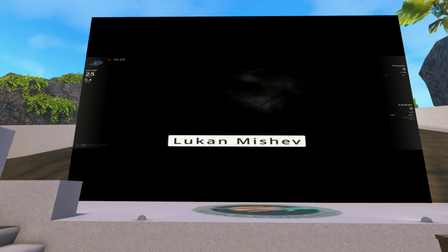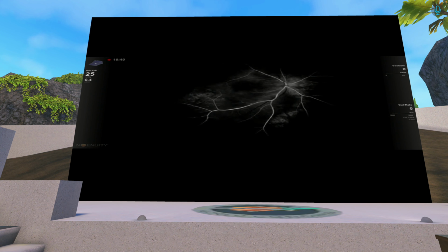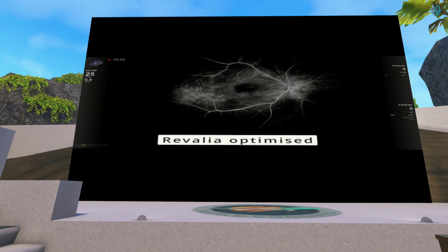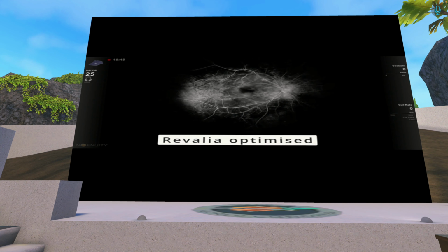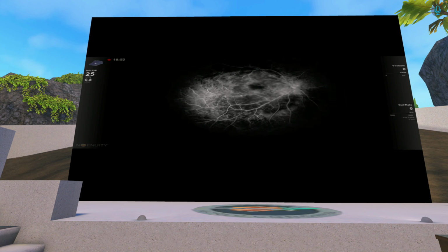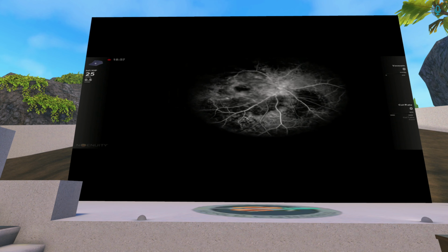Lukan, these are beautiful cases, as you always present. Just a couple of questions. You mentioned the light sources. I think I've seen you present something in terms of the different outputs of the different light sources.